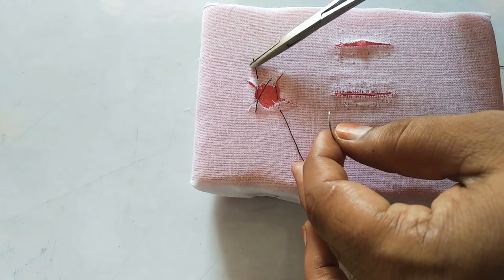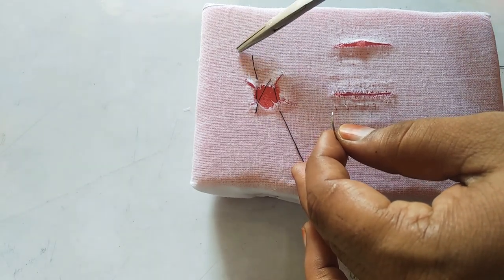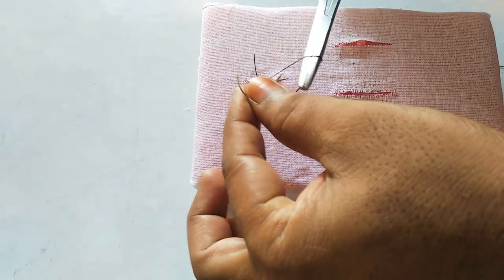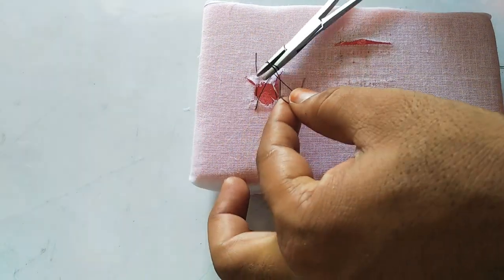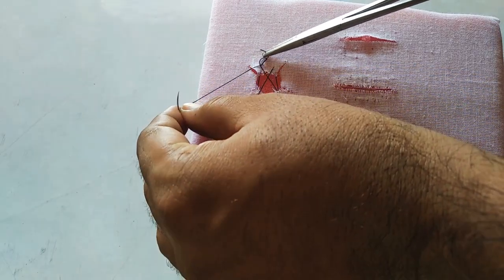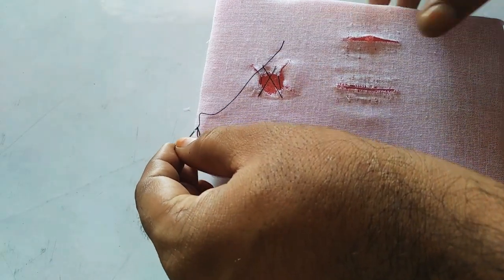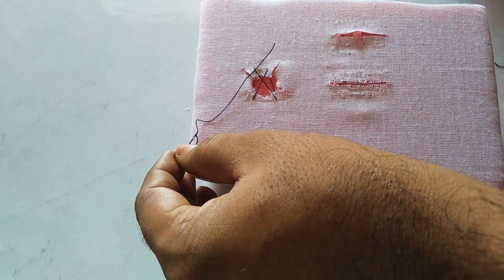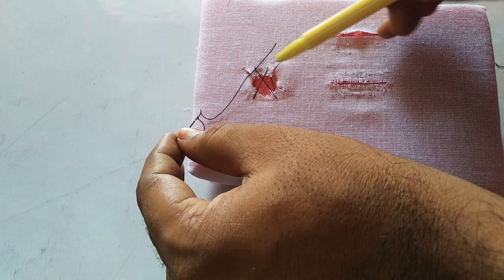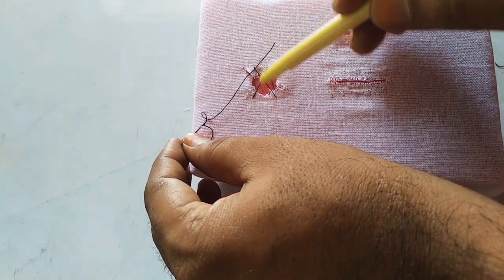The short end is on the buccal side at the mesial interdental papilla. You tie with that — you can go for any knot; I will go with the surgeon's knot. You can see here there is a complete figure-of-8 formation.